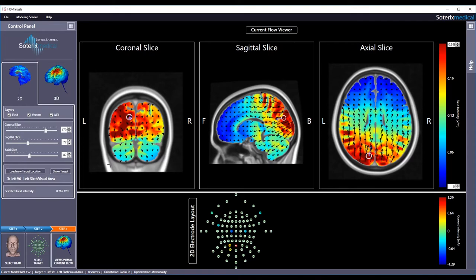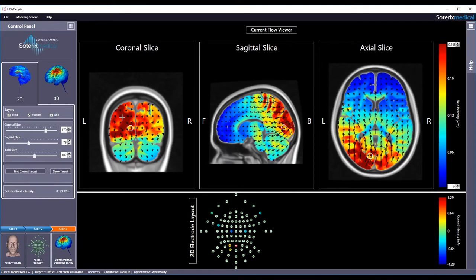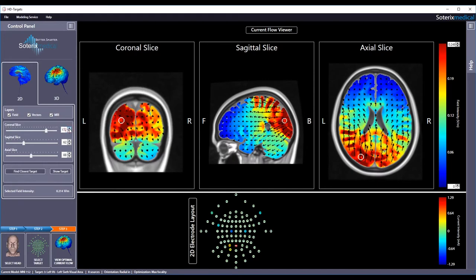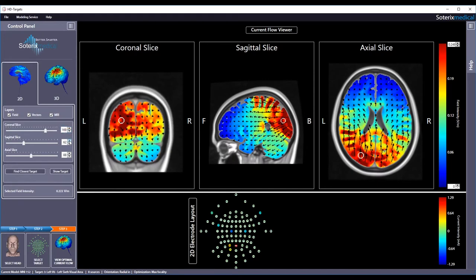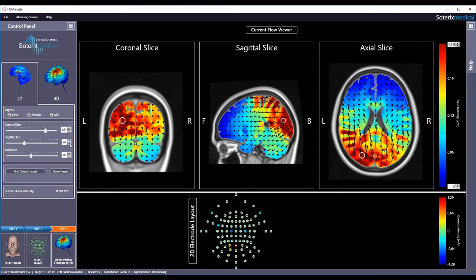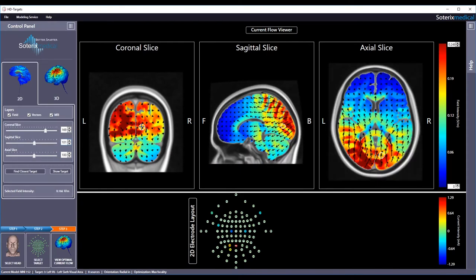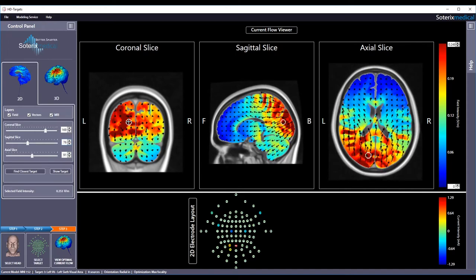You can navigate through the head by simply clicking around the 2D space or moving slice by slice at a 1mm resolution by using the sliders in the control panel. The selected field intensity value will constantly update, always showing the field intensity inside the open white circle. You can use this feature to determine the field at any voxel in the head.